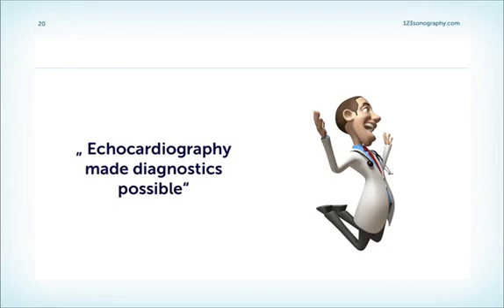So echocardiography greatly impacted also the treatment of endocarditis because for the first time it was possible to directly visualize the infection, not post-mortem, but pre-mortem. Not only see the indirect signs of endocarditis with the help of auscultation, but to really see and visualize the infection. And early diagnosis is the key to successful treatment of endocarditis. You will see that over and over again.